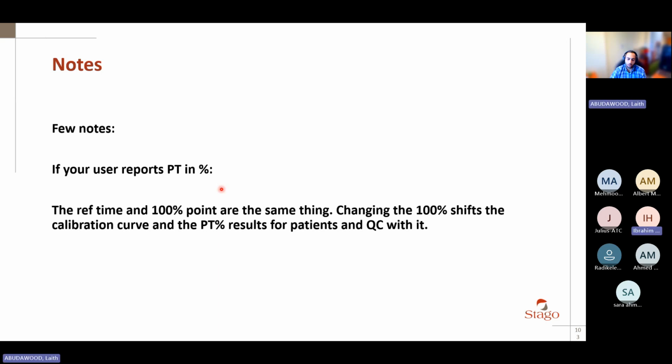Yeah. The measurement of uncertainty from the primary standard all the way down from the manufacturer standards to the customer calibrator. It decreases, right? And from the customer calibrator to the sample results also the measurement of uncertainty decreases a bit, no? So how come it changes like that?